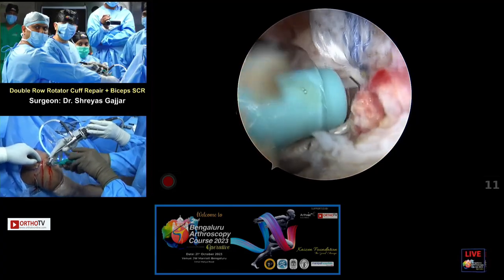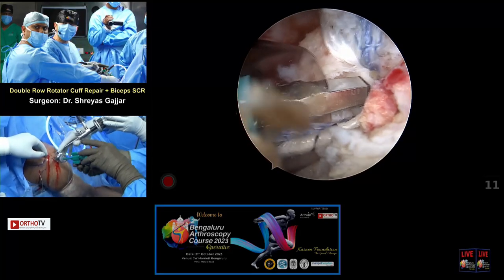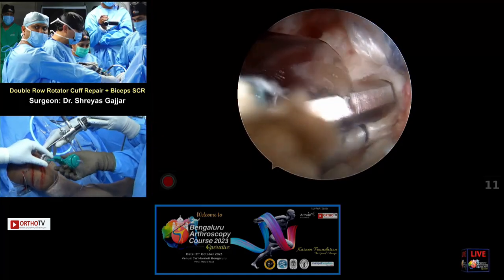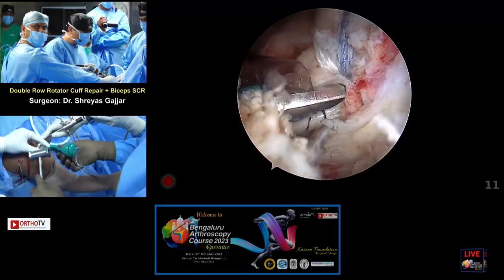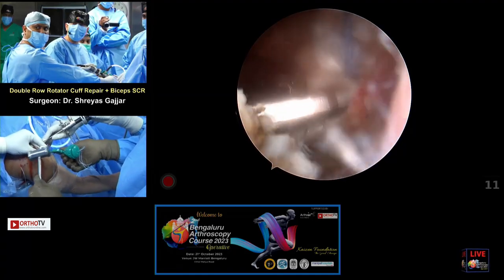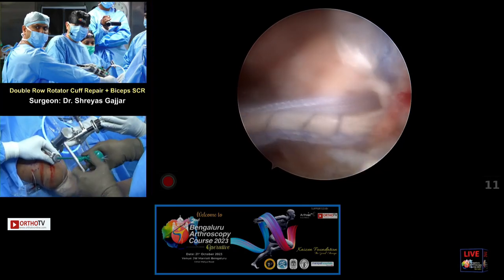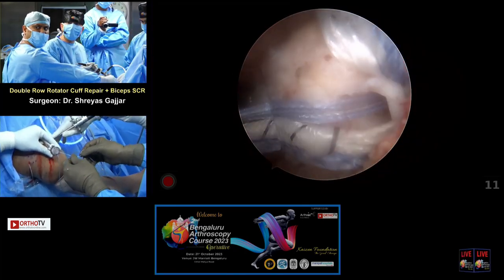Withdraw the thumb sleeve to ensure that it is flush. You don't want to bury it because it's soft bone underneath, so just flush is good enough. Remove the inserter handle. Hammer, please. Hold the cannula. Very good. Again, while removing the inserter, to remind you, just ensure that you visualize so that the anchor is not backing out. Then you can use this eyelet stitch for dog ear reduction if you feel so.